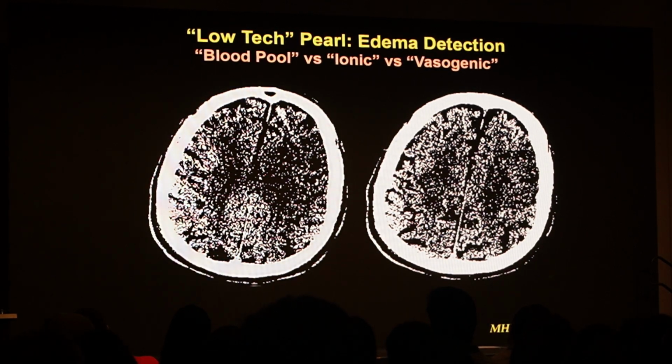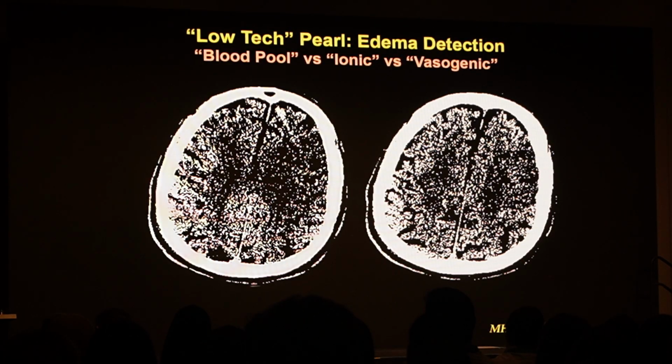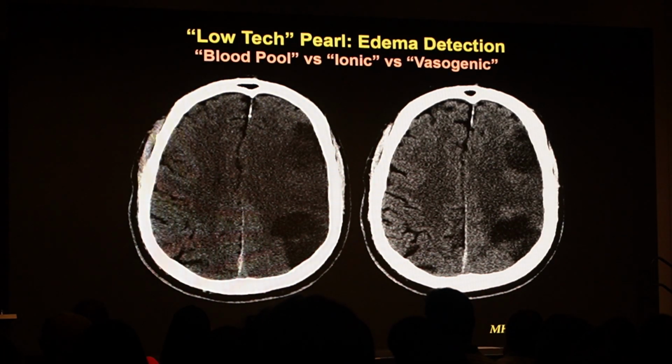And we've come full circle, because we wrote this paper over 20 years ago, but we're writing a new paper that we're sending out on Friday, which is 2 days away, to see if it'll get published. I'm going to show you some of the preliminary results from that, but it comes back directly to this. And basically, this is the follow-up scheme.